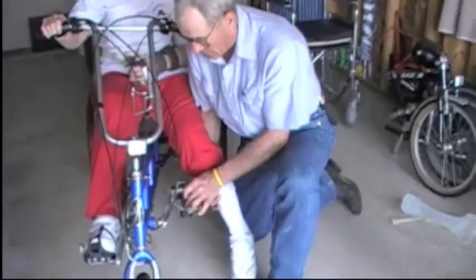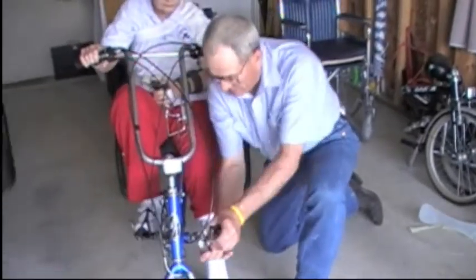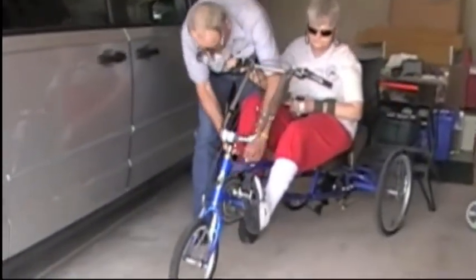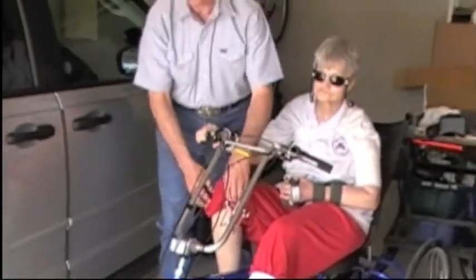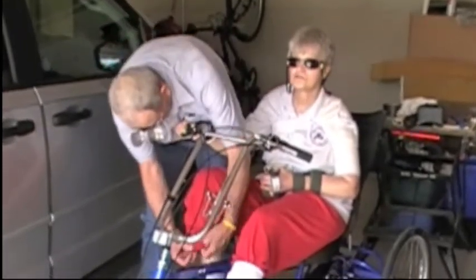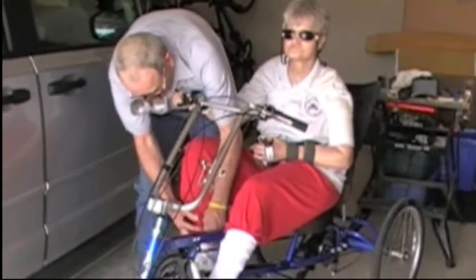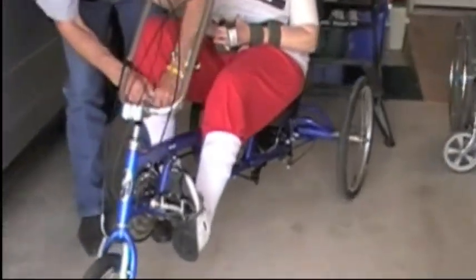With the left arm, the left leg — her brain won't allow the left leg to pedal right — but it will follow along. Now let me tuck the pants legs in; there's a reason for that. You may remember they used to sell chain clips — if anybody's my age or older — they went around your pant leg to keep the chain from gathering up your pants. Well, here's our chain clip: we just use our socks to tuck the pants down into the socks.